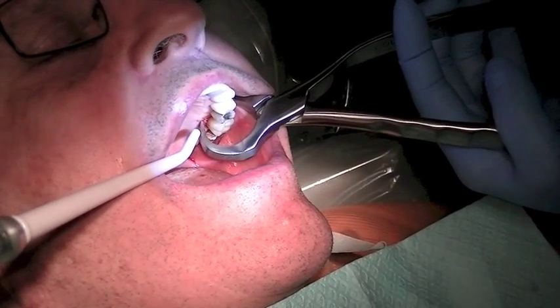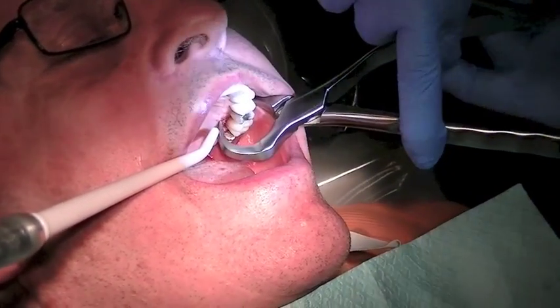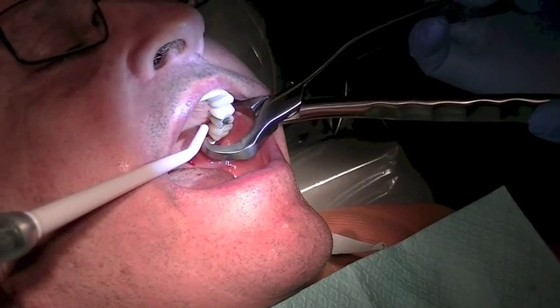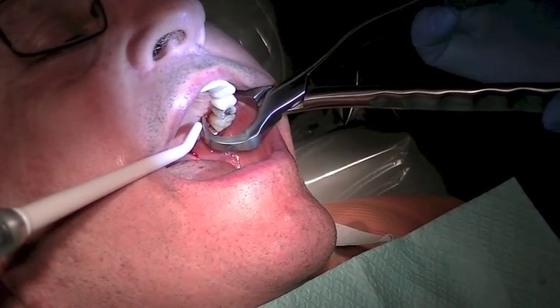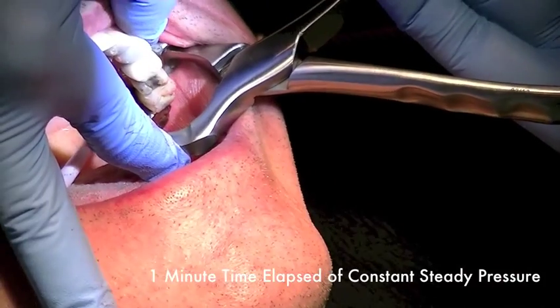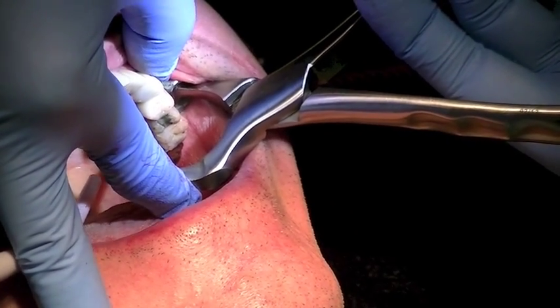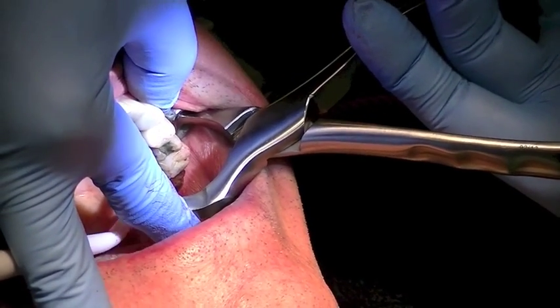And now I'm not squeezing my instrument — I'm just rotating. It may take three or four minutes for our tooth to loosen and that's fine, because the ligament around the tooth is being broken down by the enzymatic action.